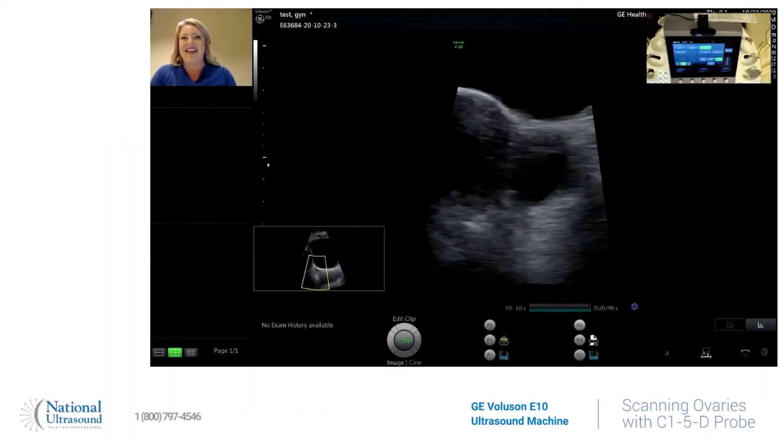Hey, this is Holly. I am live at National Ultrasound today. I am a registered cardiovascular, general, and OBGYN sonographer since 2008, and today I am going to show you how easy it is to find your ovaries on a GE Voluson E10. It is known in the women's healthcare world as the best OBGYN ultrasound machine.